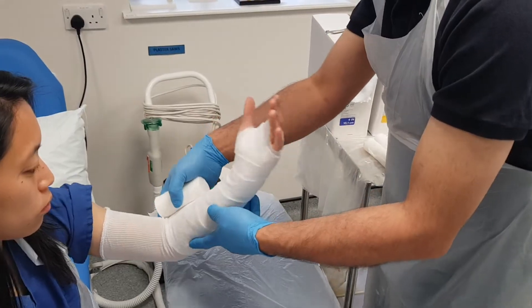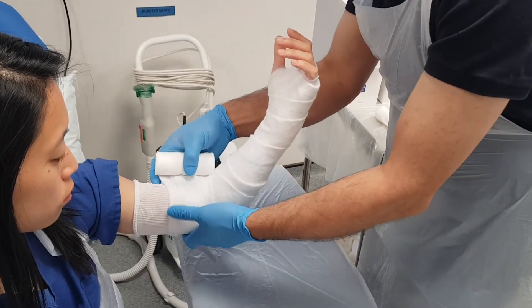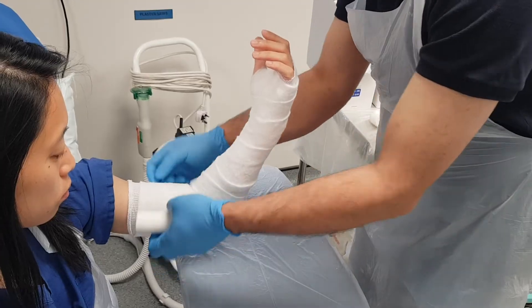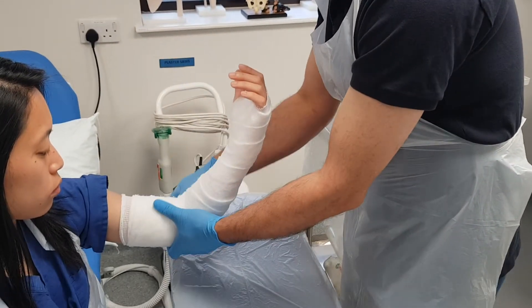Now we're going to have the arm bent at about 90 degrees. It might be necessary for your patient to hold the arm across their chest using their other arm in order to keep it comfortable while the plaster is being applied.